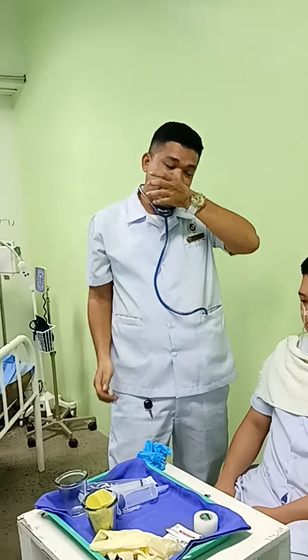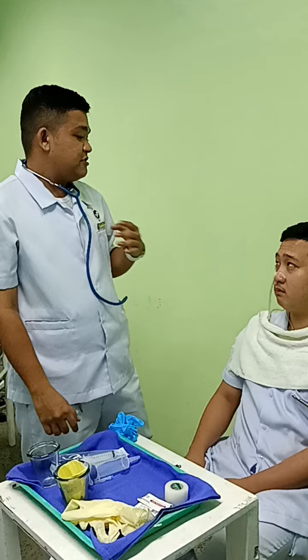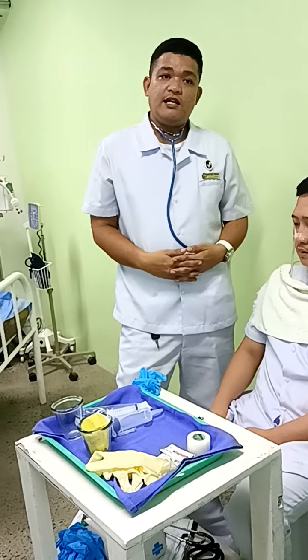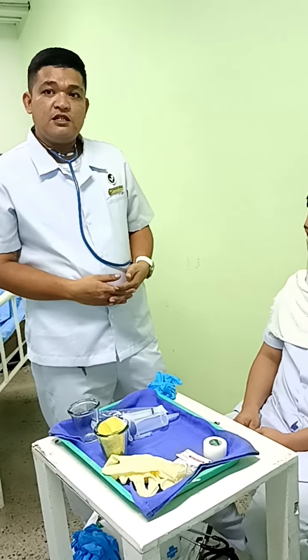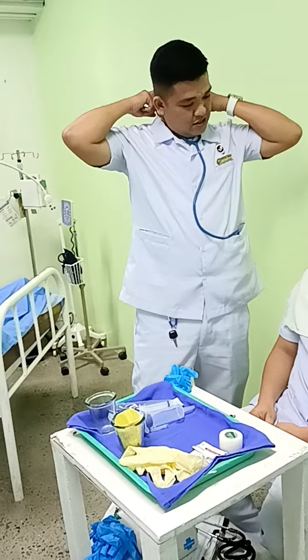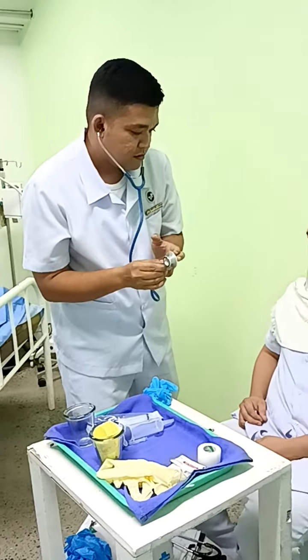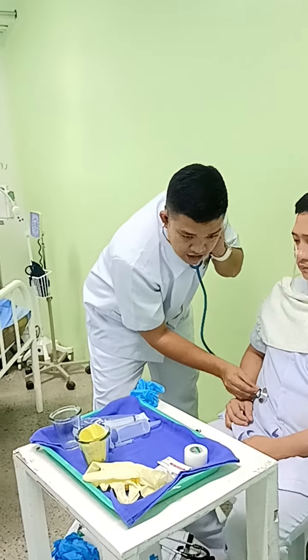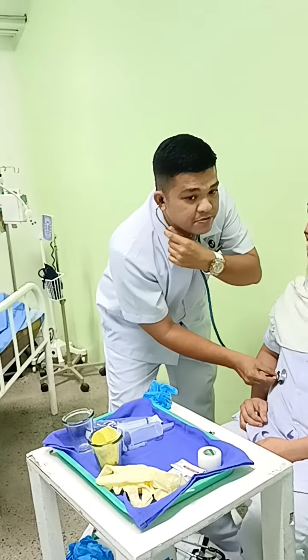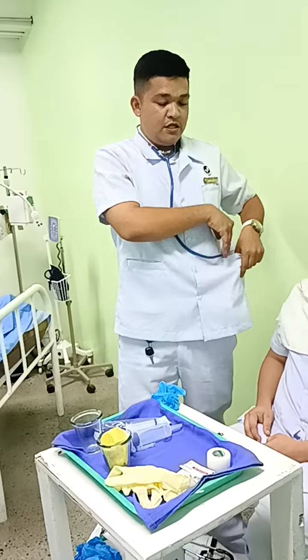So for the next procedure, we have here the enteral nutrition administration. Before that, we're going to assess the patient's needs for enteral feeding. Next is to auscultate. And then we're going to start now for tube feeding. We wait for normal bowel sounds, which is 10 sounds per minute. Next is to irrigate the tube first with water.